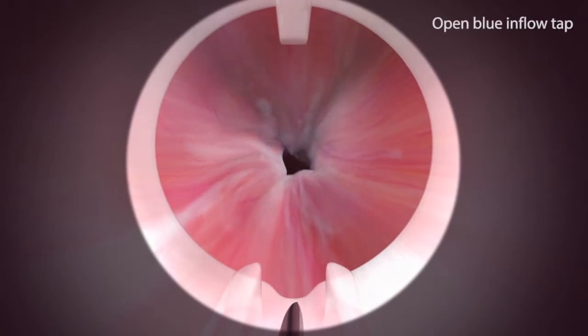Open the blue inflow tap on the irrigation tubing and close the red outflow tap to allow 150 to 200 milliliters of water into the bladder. This will help to stabilize the urethral wall during each injection.